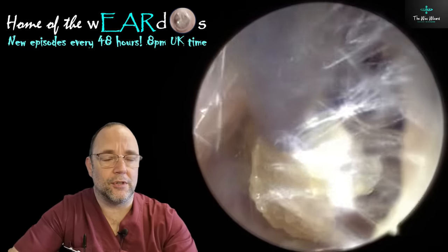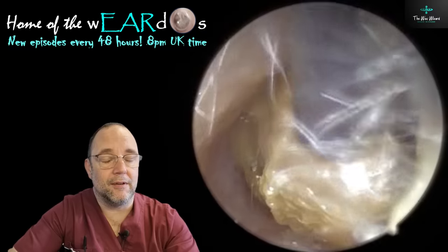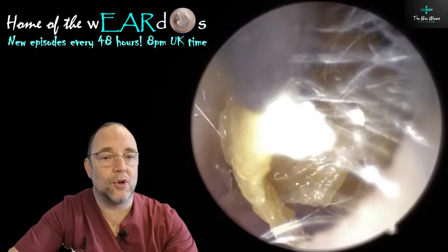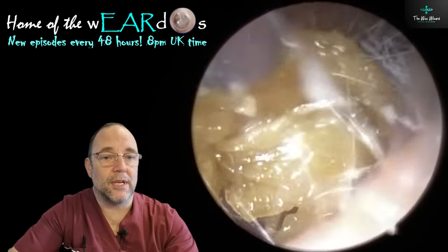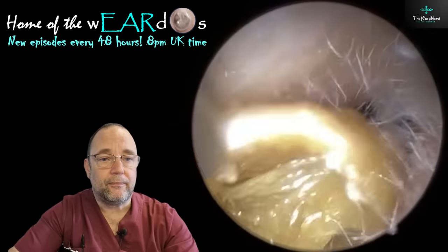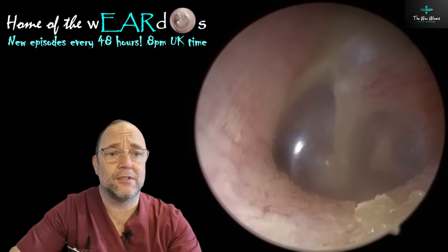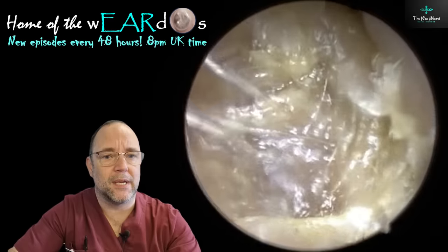The last one wasn't oiled at all. He'd had his done a few weeks ago, and he had no intention of getting his ears done with me today. But when somebody else comes with the patient, I always ask them - for no extra charge - they'll jump in and have a quick look at yours while you're here. And you'd be surprised what we find in people's ears that are not expecting to find a problem - sometimes some potentially serious things as well. So it's always good to ask, and I always try and make time.